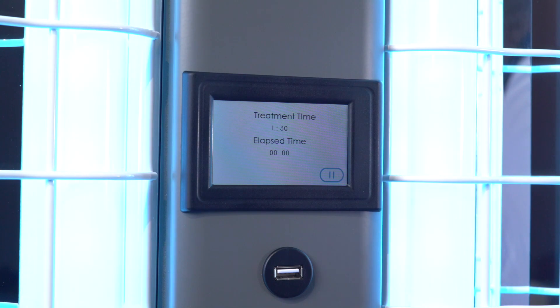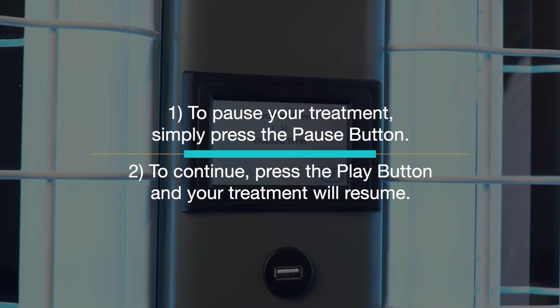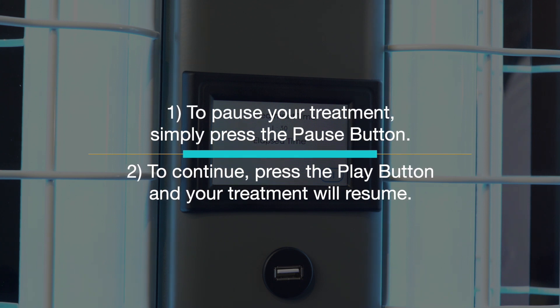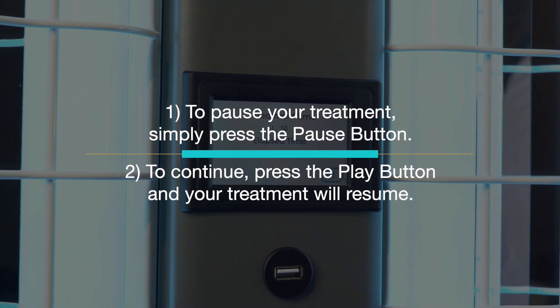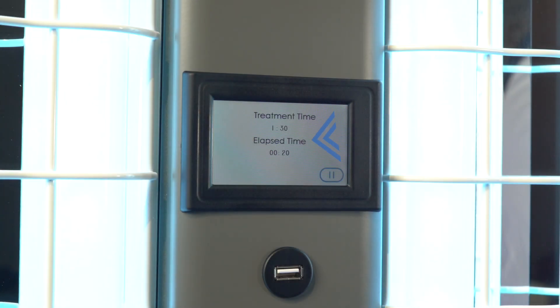There will be a 3-second countdown so that you can make any last-second adjustments, and then the lamps will light. If you need to take a break during your treatment, simply press the pause button. When you return, press the play button and your treatment will resume. The ClearLink controller screen will display live treatment information, such as elapsed time.